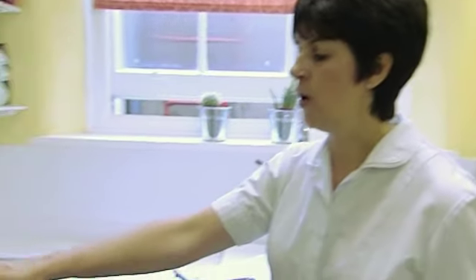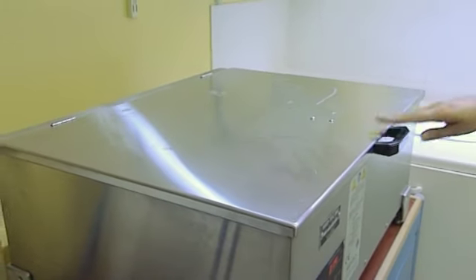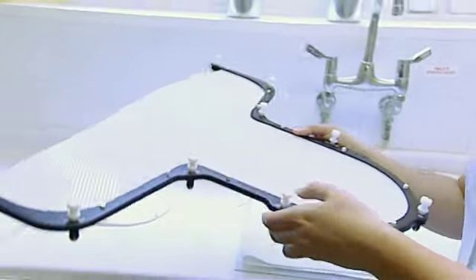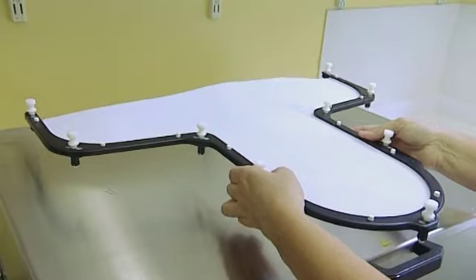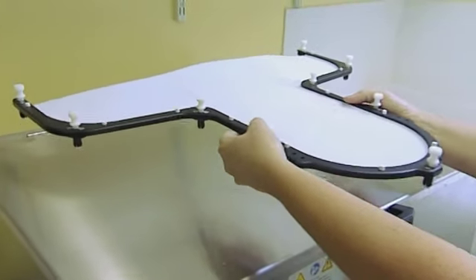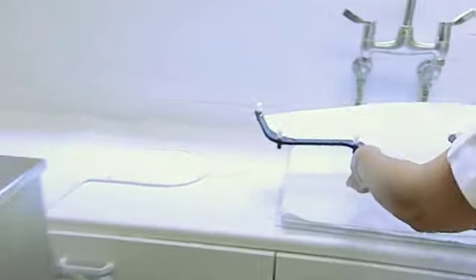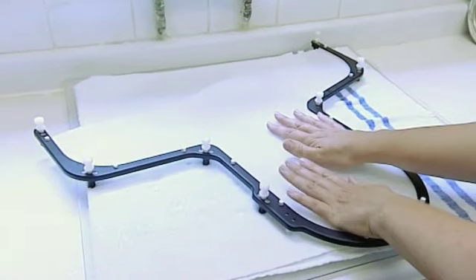This is the hot water bath that we use for warming the Orfit. It's set at 75 degrees Celsius. We bring the Orfit over, which is in a frame, and pop that into the hot water bath whilst we're positioning the patient. We leave that in there for approximately two minutes, where it becomes soft and pliable — it's not sticky at all. We bring that out of the water and just pat out the excess moisture on the side.